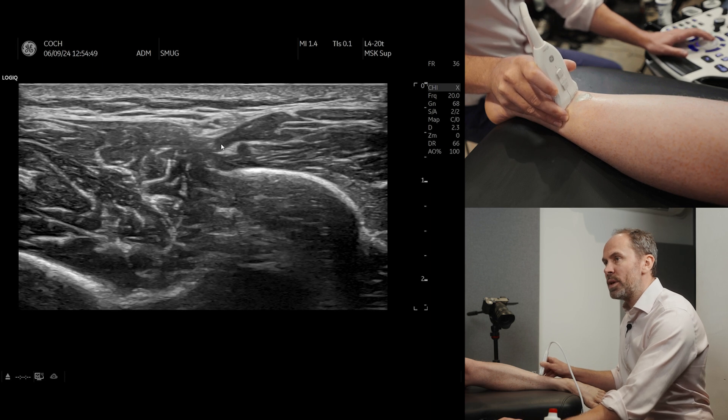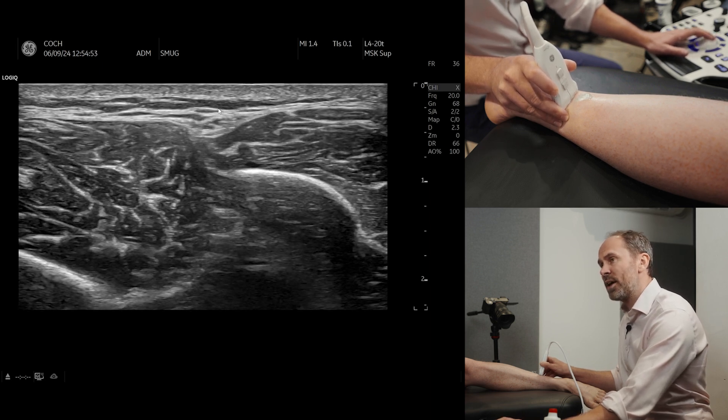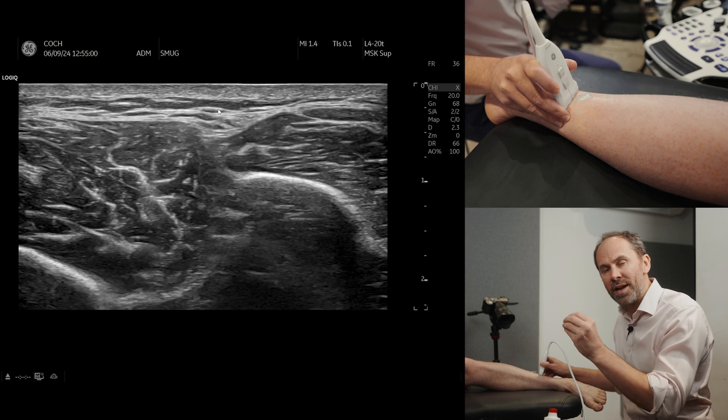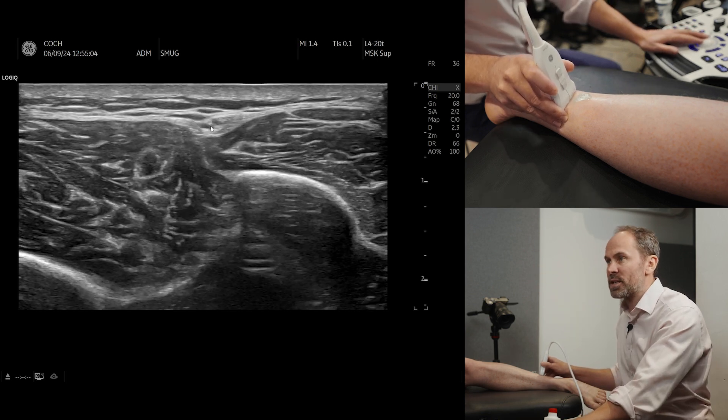Now if we go between these two structures we will see the nerve. This is the subcutaneous fat layer here, and remember you're going to get the entrapment — it's going to start deep to the fascia. The entrapment point, where the nerve often gets thicker, is when it goes more superficial into the subcutaneous layer.